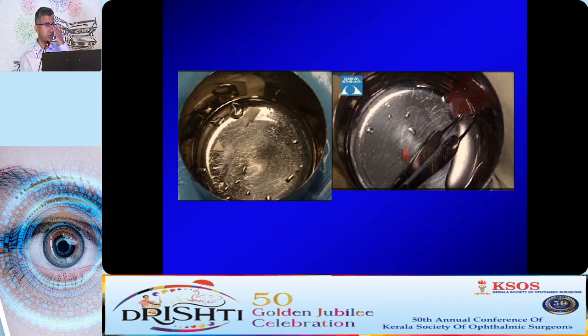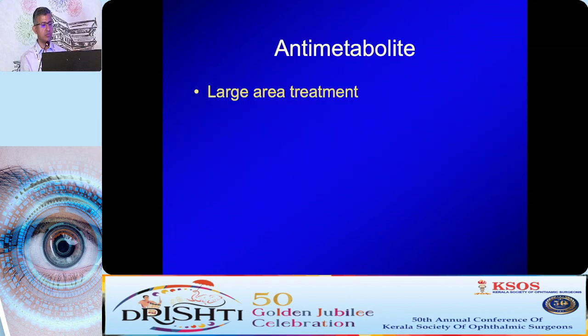It's important that you do not take shortcuts on this. You do not decide to use something like cotton, because those little fibers, once they are soaked in mitomycin and left, will not come out from under the conjunctiva, and they will stay there and cause problems.